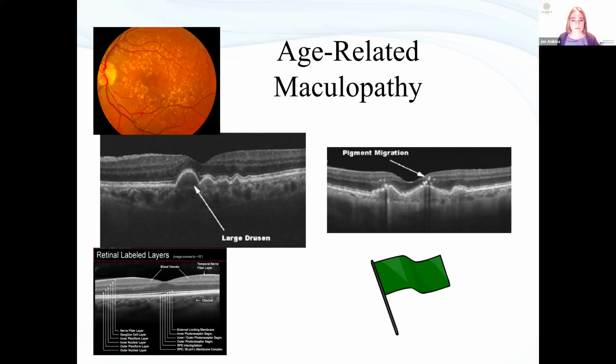So how does membrane and CNV? How does SRH? I'm not quite sure what you're referring to. The difference between CNV and... is that subretinal hemorrhage? Is that what you mean? If you mean subretinal hemorrhage, that's my favorite topic.